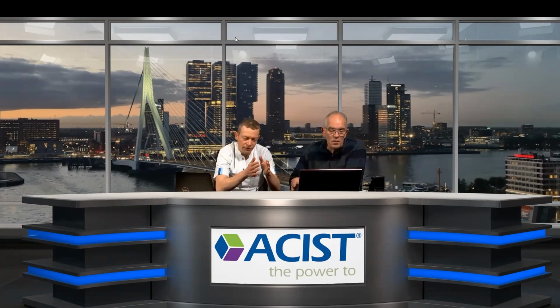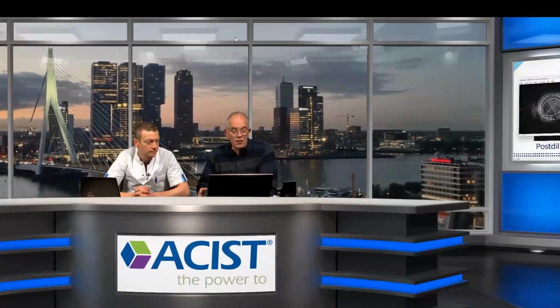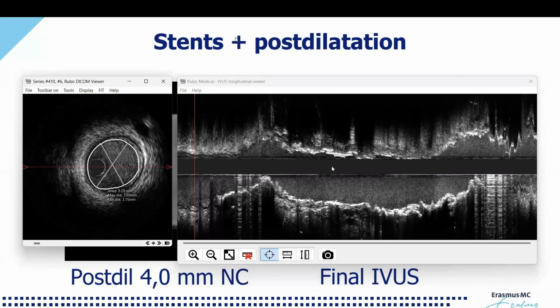But if the distal reference area is in a segment in which you have a plaque burden of 60%, this reference lumen area is not representative of the healthy reference. So always keep in mind, what am I measuring? What am I doing? Exactly. And only then can you properly interpret the definitions and the guidelines that people like us like to give you. Now look at this, normal vessel 9.28. What did we measure? Minimal luminal area? Was also 9.2, a little bit less, but definitely more than 90%. Yep.